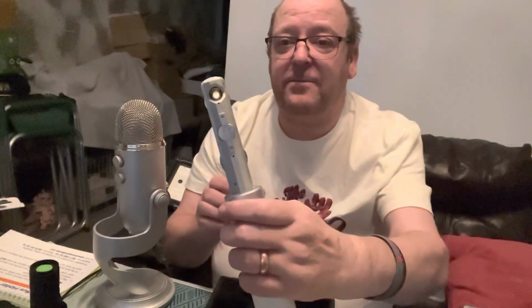I now have a special instrument. This is an ophthalmoscope, and it looks rather an unusual instrument. What I've got here is, if I turn the power on, you can see there's a light shining at the back there. And what I would do on this front, there is a dial, and it has the different powers. So I would look through this, looking into the eye, if I set it at 0 because of where I'm sitting, and now I've got a clear view.